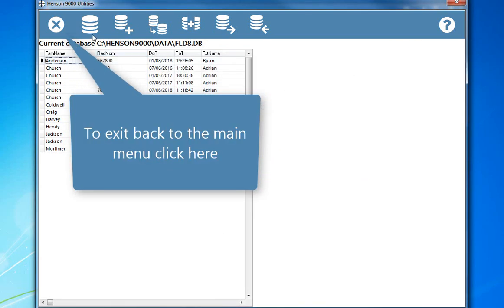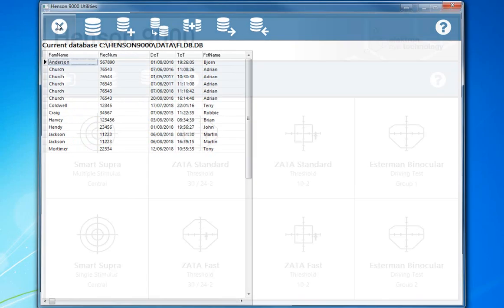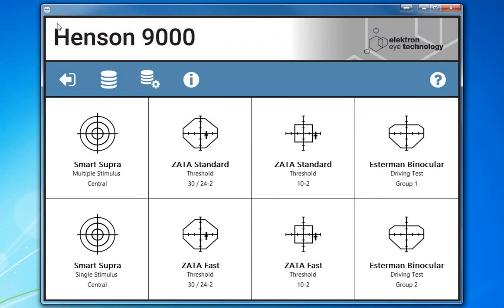To exit back to the main menu, click here. The exit tab here.